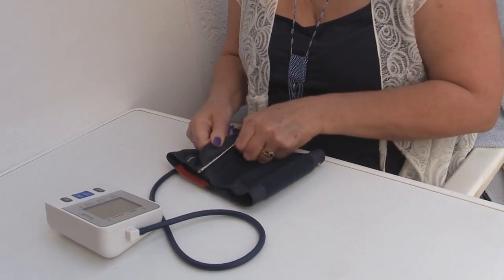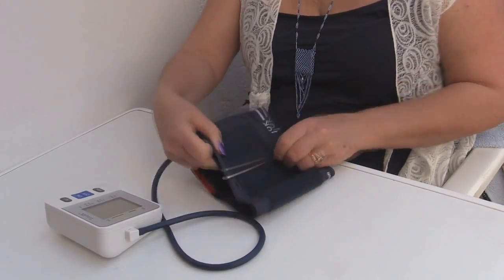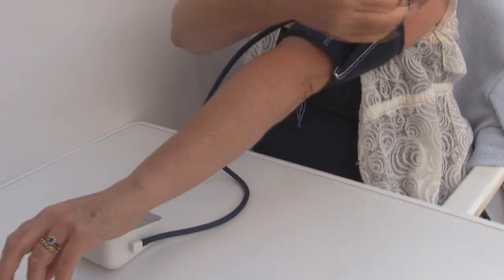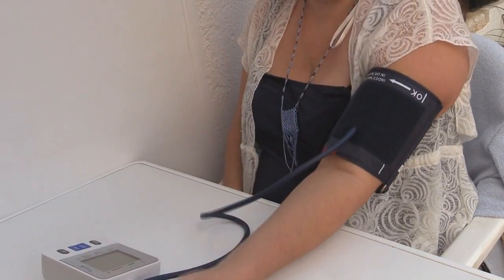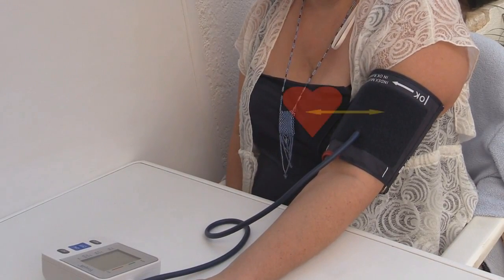Then place the cuff around your arm 2 to 3 centimetres above the elbow and fasten the velcro strap. The correct position of the cuff is with the tube on the top. With your arm straight and your palm facing upwards, make sure that the cuff is level with your heart. This is very important.